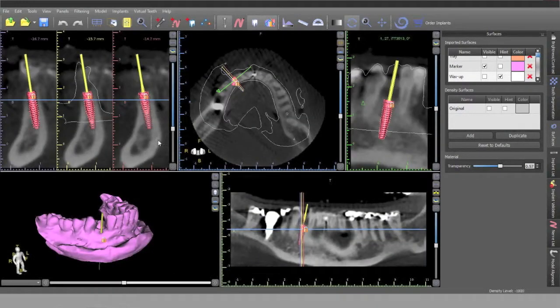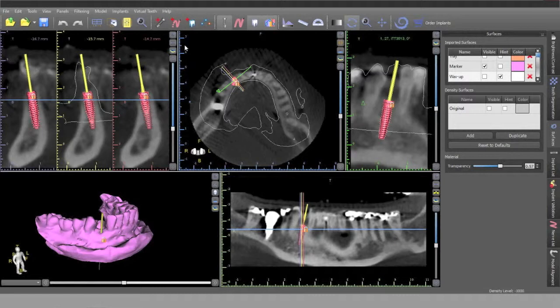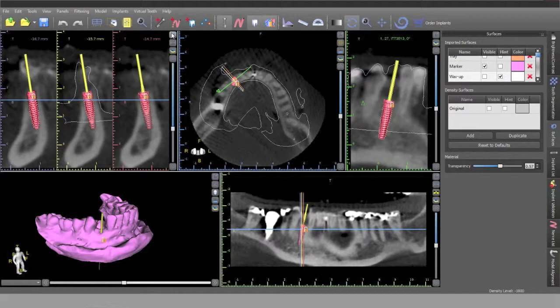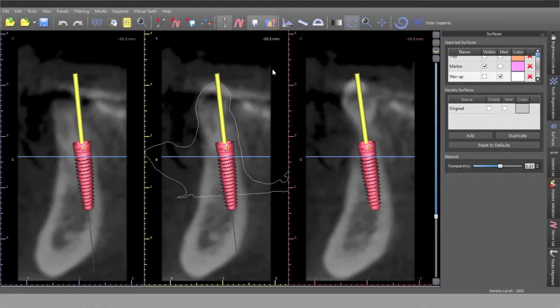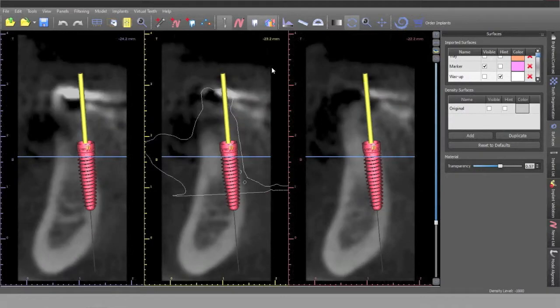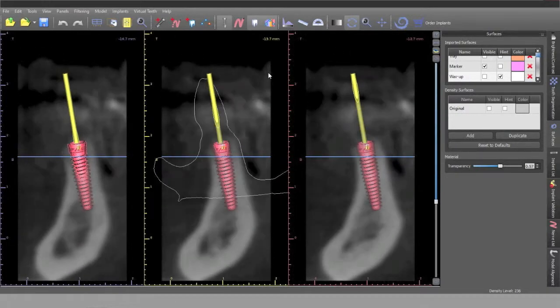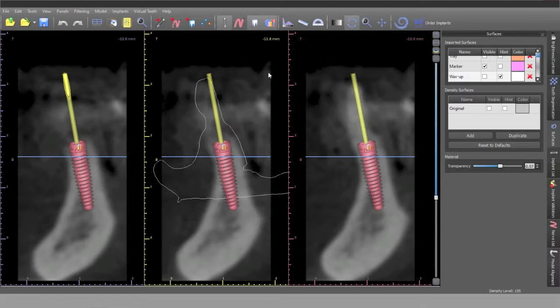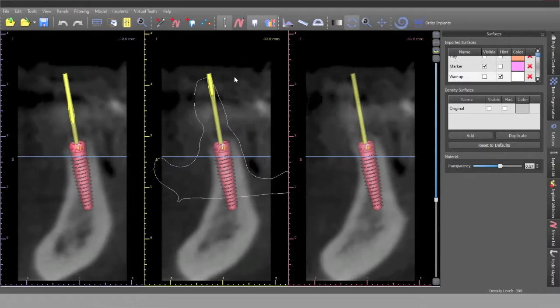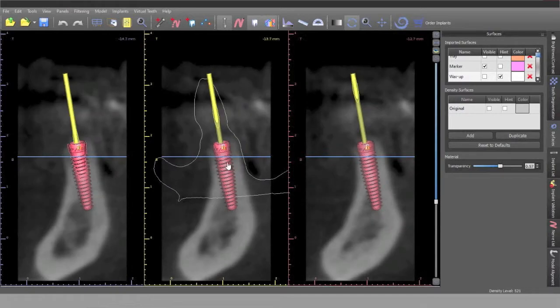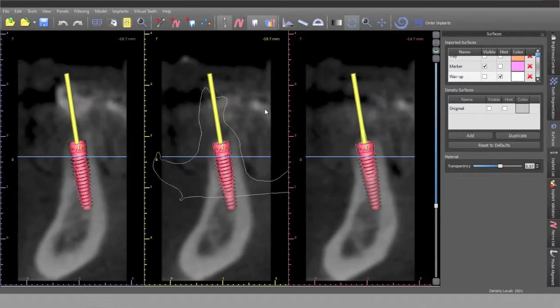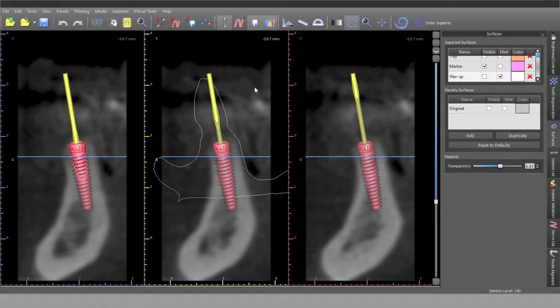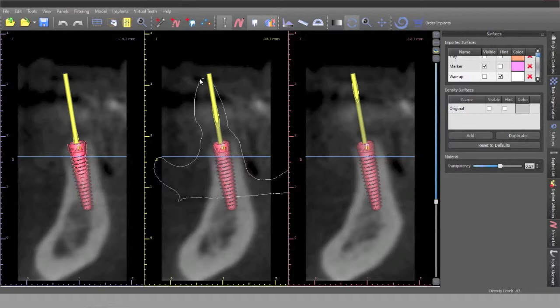And then when we go back to the bone, we superimpose the wax-up on the cross section of the patient's bone. So here you can see, this is a cross section through the wax-up. And you can see the bone is relatively thin. But also, there's every reason that this case should come out just beautifully because I know where the future tooth is. And that's the key.